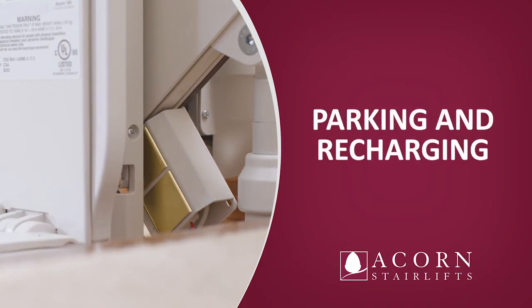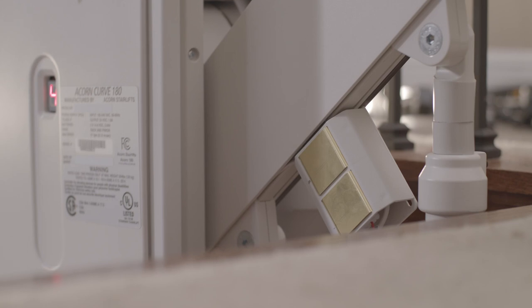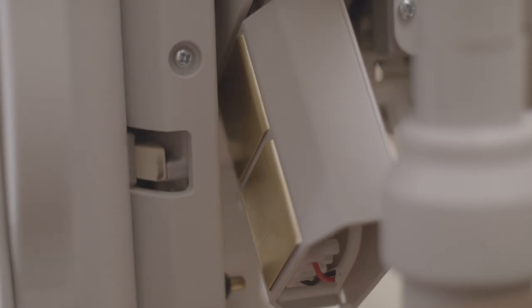Parking and recharging. When not in use, it is vital that the stairlift is left on a charge point. The location of this can depend on the configuration that was installed in your home. On a standard track, the correct positions are at the top or bottom where the unit stops automatically. At these positions, the unit receives a power supply that allows the unit to recharge its internal batteries. The stairlift will make a single beep to indicate that a charge point has been reached.